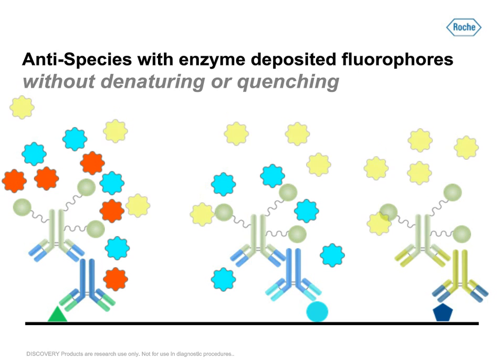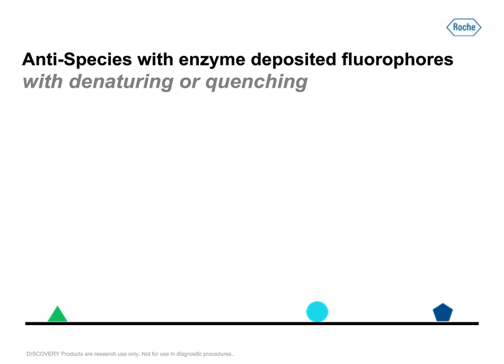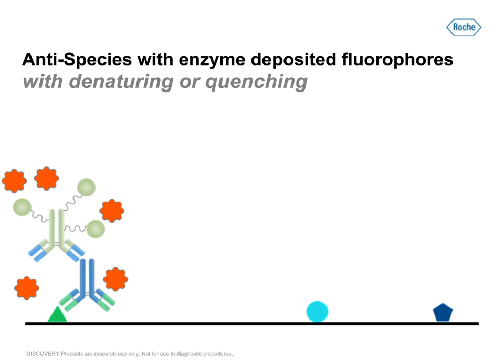So just to walk it through, if you were to actually do it with an elution step, you deposit your first round of fluors, which are covalently bound to the tissue. So when you apply the heat or a low pH solution or any method to elute that antibody from that first sequence that you're detecting, your fluor remains, intact and non-bleached.